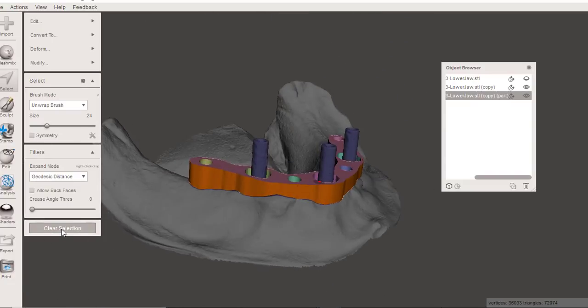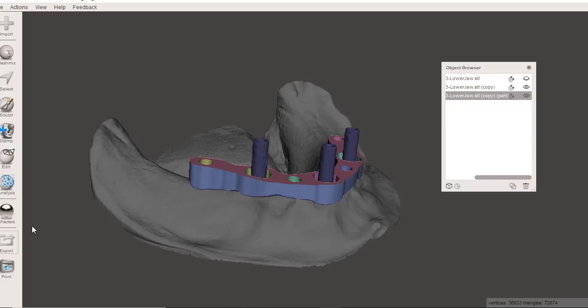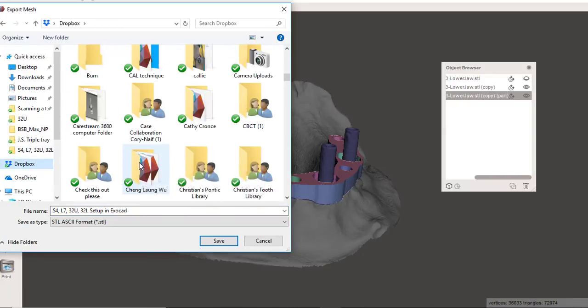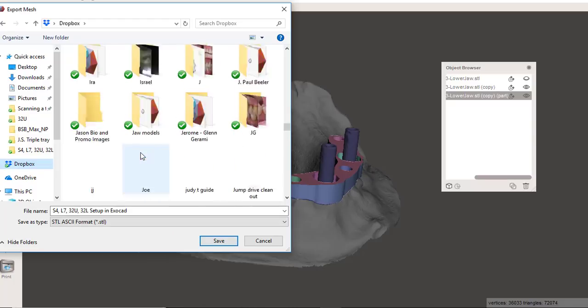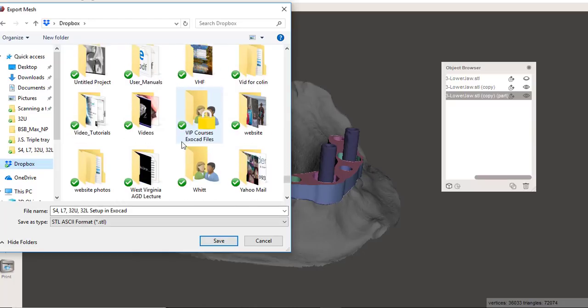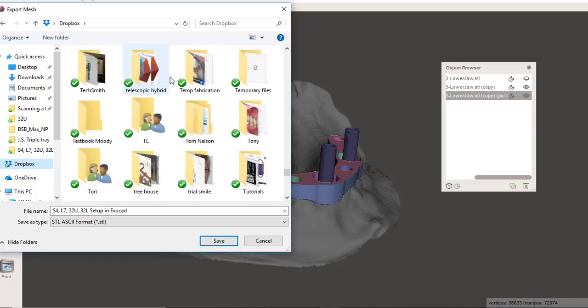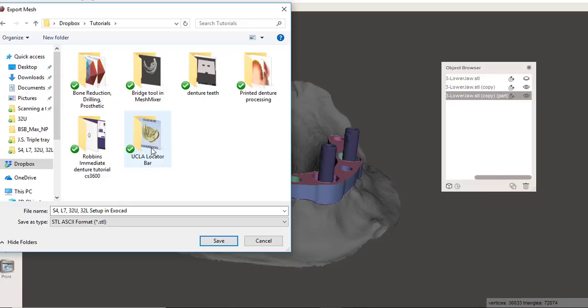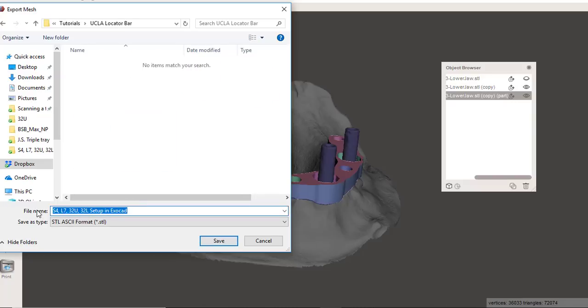Now I'm ready to export this. So I'm going to go to Export Data, and we're going to put this in the folder where I'm keeping track of this. This is in my tutorials folder. Here we go. And this is UCLA Locator bar, and we're going to call this bar to be printed.